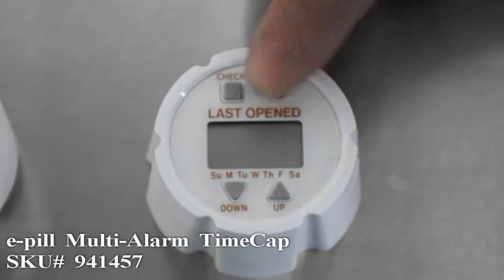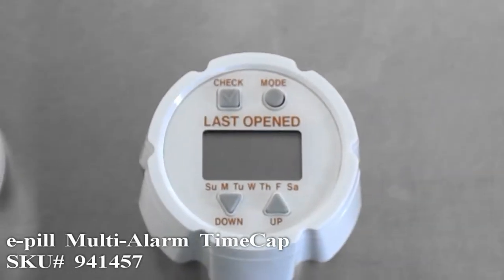You can then tap the mode button again, and you can now change the day of the week. We will set it to Saturday.